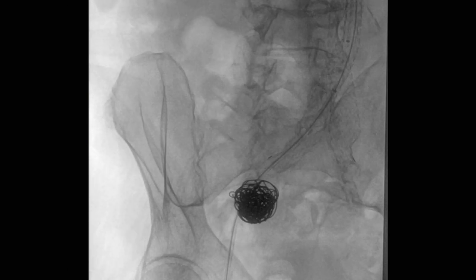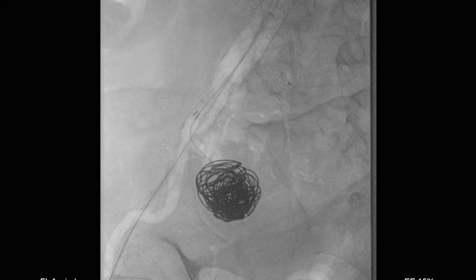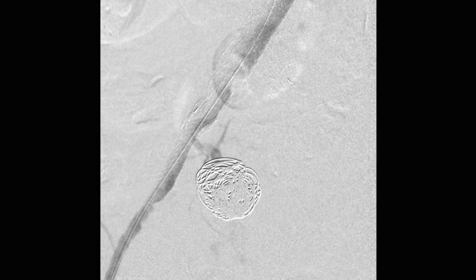We did have a problem and we'll show you what happened. The sheath is up and we continue packing — you can see the deformity that's occurred with the wires in there. We're still packing more coils into the origin of the internal iliac. The VBX has been brought up into place so we can deploy it whenever we need it. We blew it up and it actually trapped the catheter. The idea is to get that stem of the internal iliac so that we take that branch out.